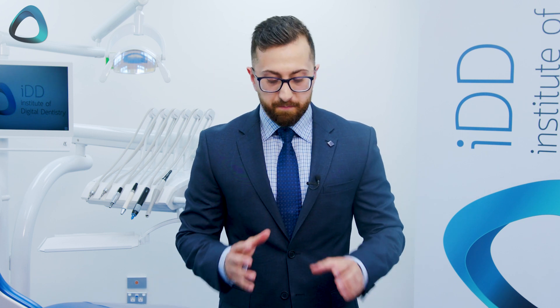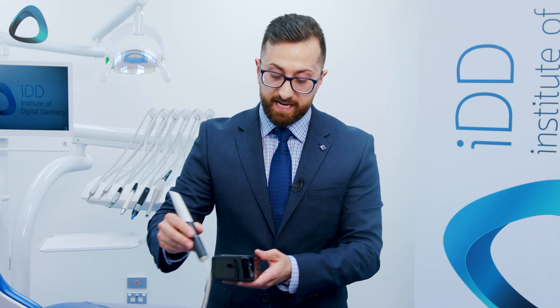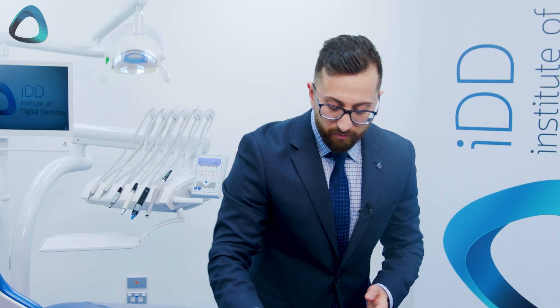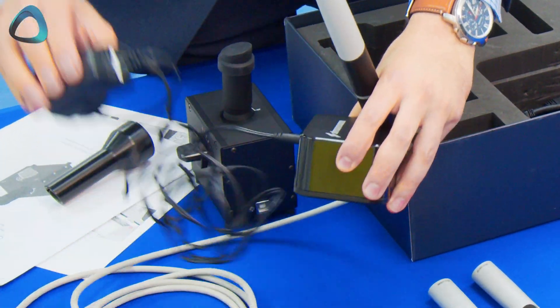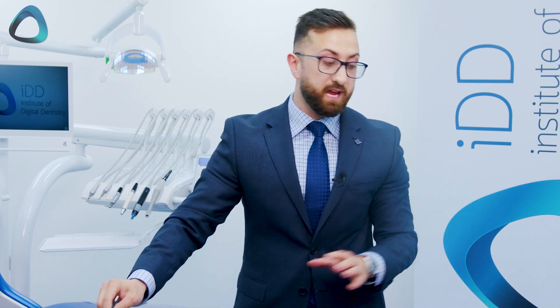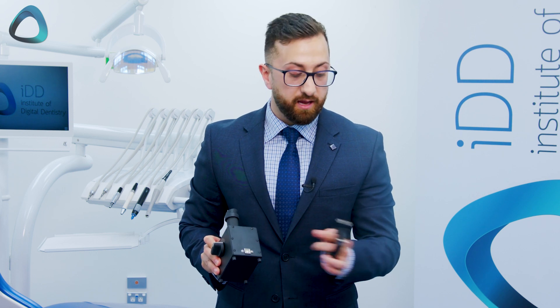Apart from that, you have a bunch of cabling and the data hub — this is the Straumann data hub. It is not a scanner that can be used directly with the PC; it must be used with this data hub, which also doubles as the stand. This is how the scanner is expected to sit on the desk. We have a standard power cable that attaches to the back of the data hub, a USB cable that goes from the data hub to the included laptop, and finally an additional USB cable used for the sharp adjust tool that connects to your laptop.